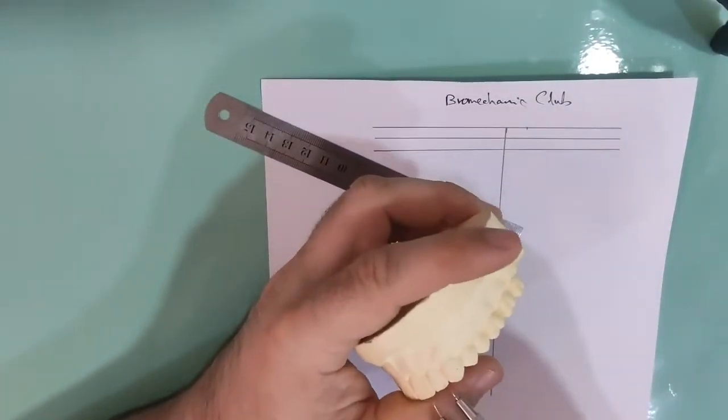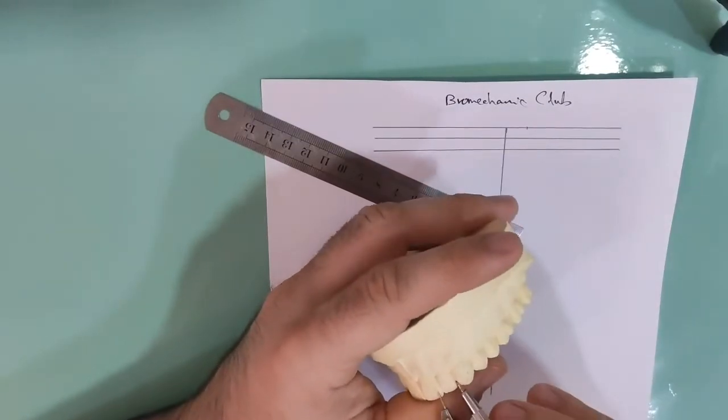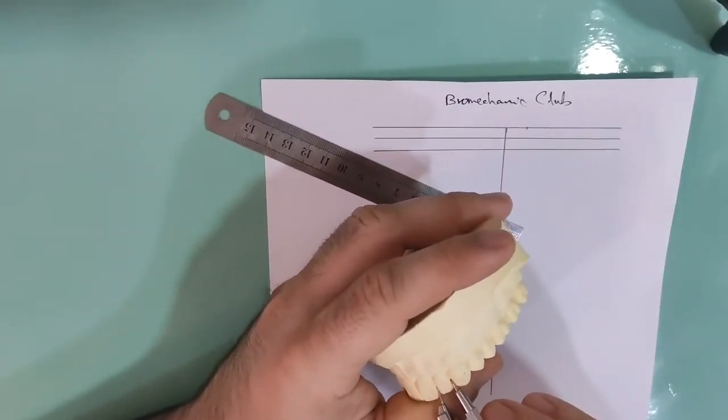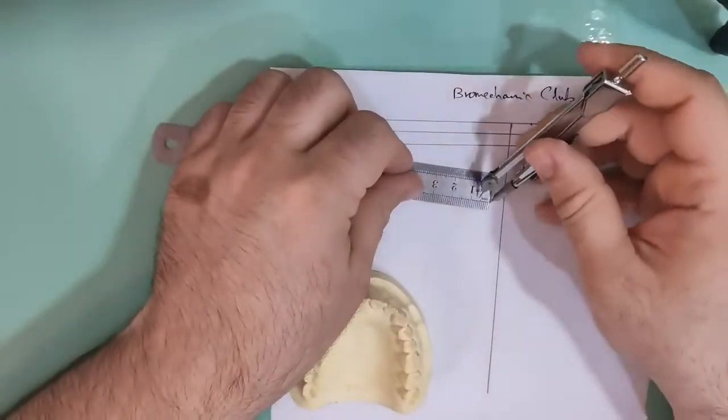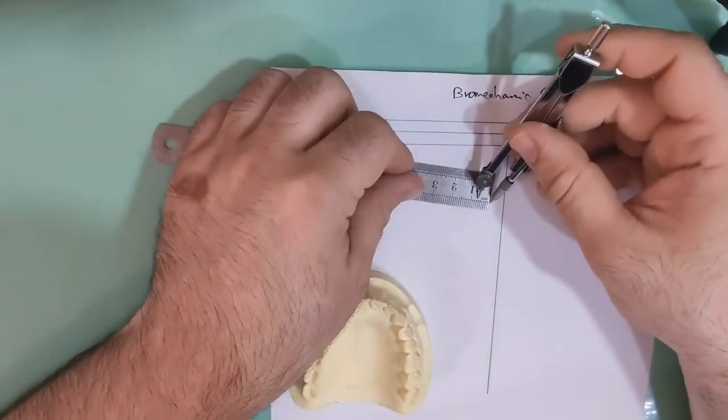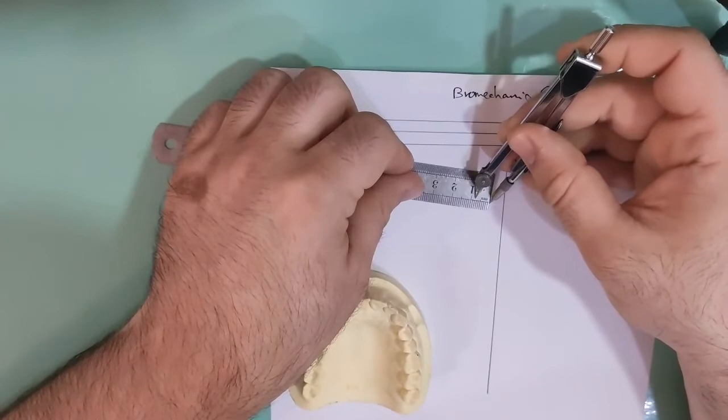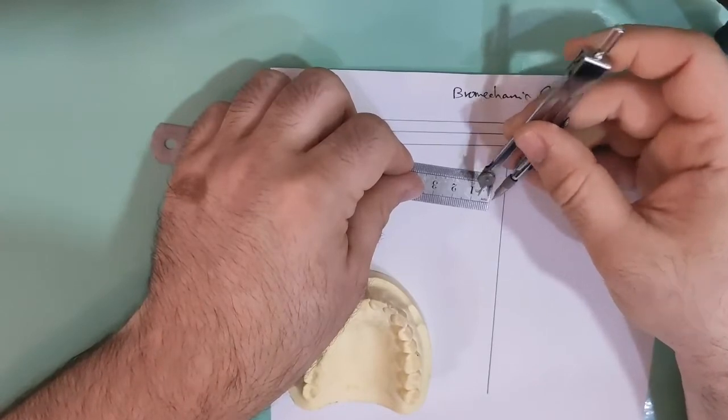Then we measure the distal width of lateral and add one millimeter also. So we have here seven millimeter, we add one millimeter, so it's eight millimeter.